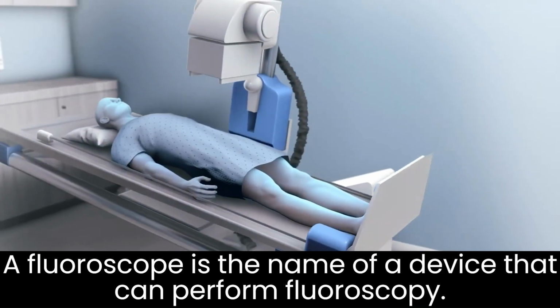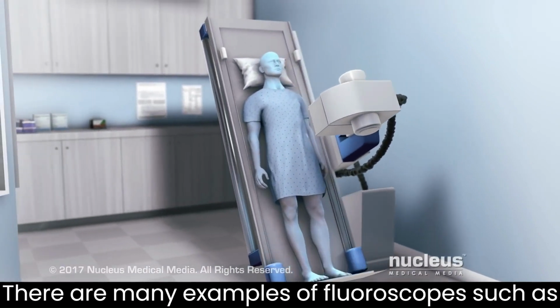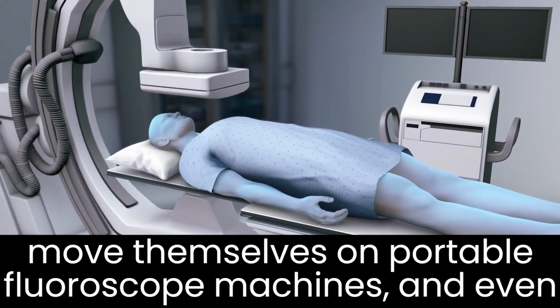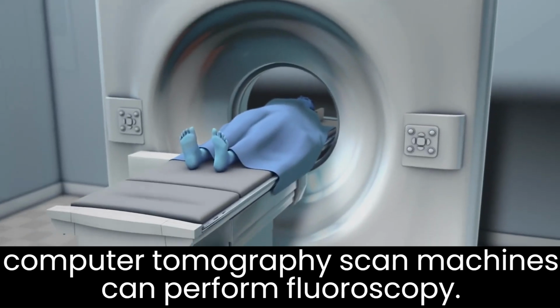A fluoroscope is the name of the device that can perform fluoroscopy. There are many examples of fluoroscopes, such as ones that move the patient on a table, ones that move themselves on a portable fluoroscope machine, and even computed tomography scan machines can perform fluoroscopy.